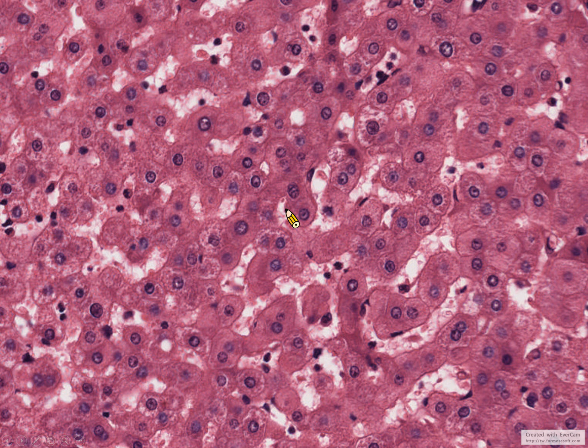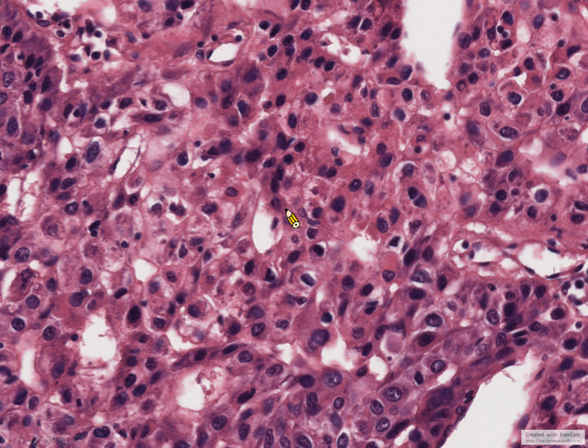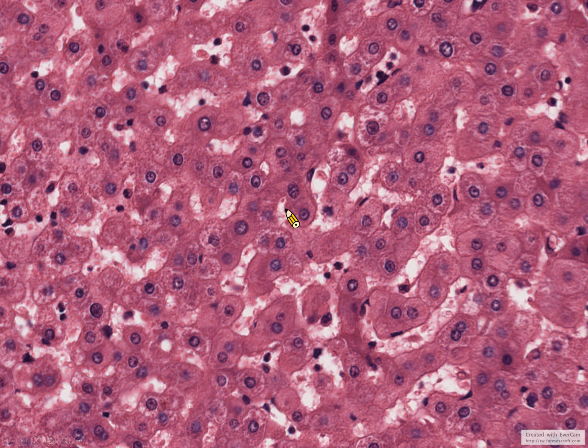I just show this one, and you probably already have some insight that these two are different. In this one, the dark purple color means the nucleus, and the light red part means the cytoplasm of the cell.